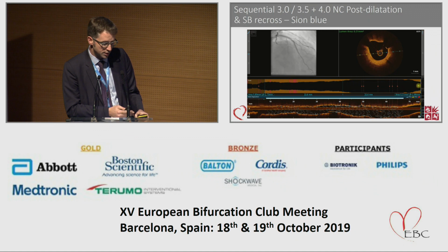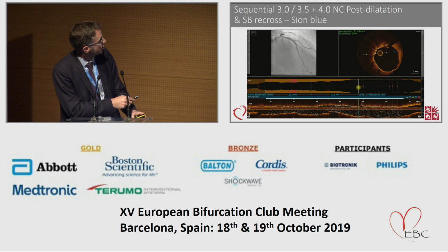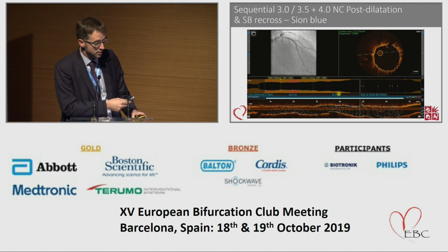So then this is the next OCT run, and I've purposefully taken a run of how to then acquire the post-dilatation measurements and metrics. Because this is a meaningful bifurcation, we actually see on the luminal profile very good expansion from the POT in the proximal vessel. And then purposefully we've brought the assessment down to the level of the carina and beyond, making measurements of the proximal and distal half of that stented segment.